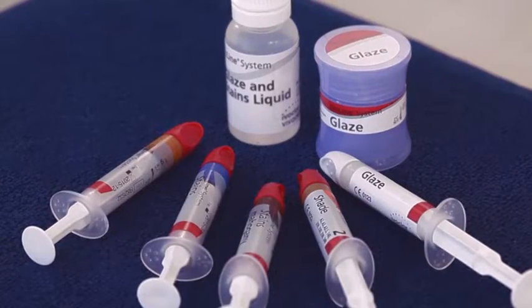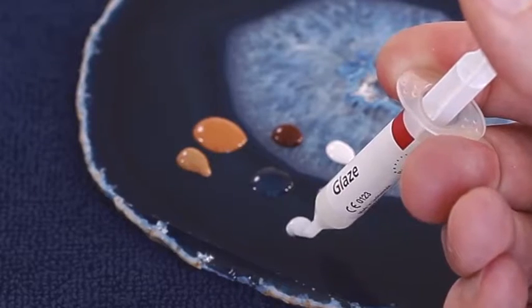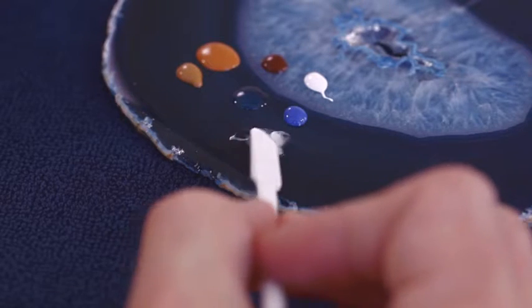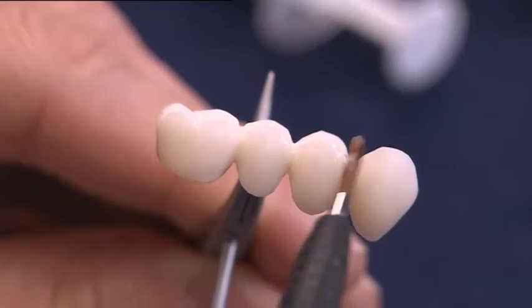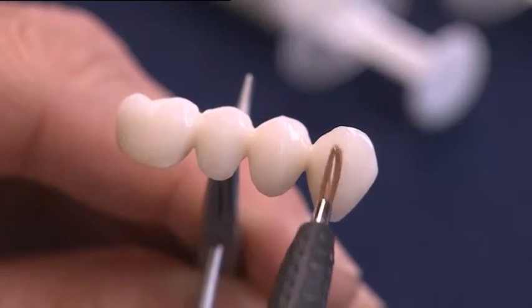Dispense the desired amount of shade, stains, and glaze pastes. Dilute with the glaze stains liquid and mix. For shade adjustments, the dentin stains can be used. If only small adjustments are required, they can be directly applied with a glaze firing.